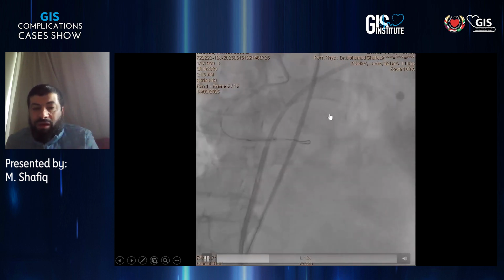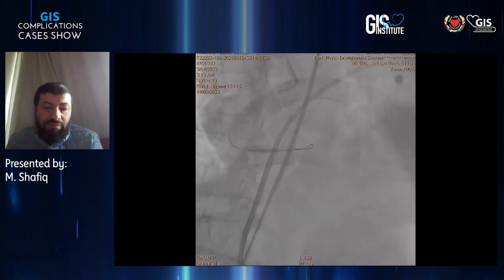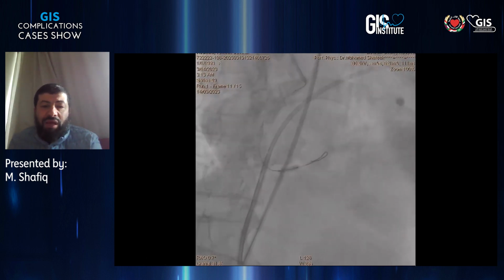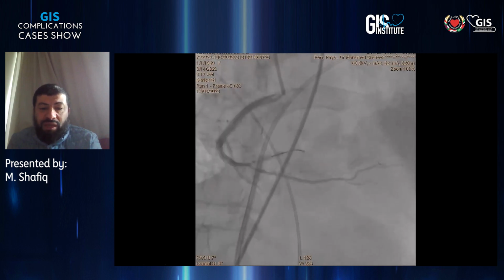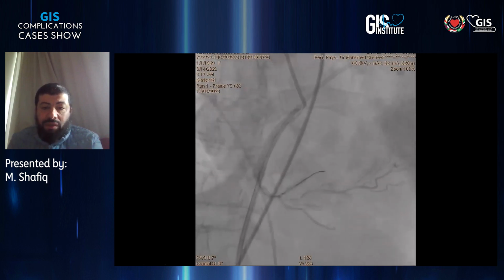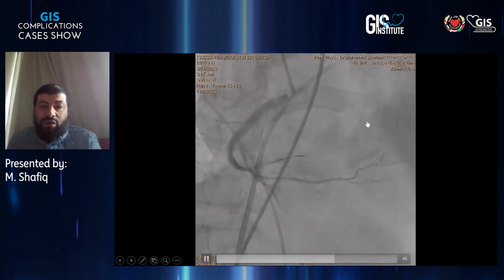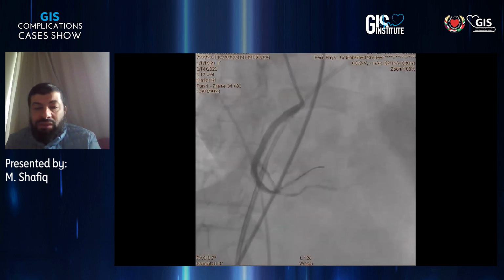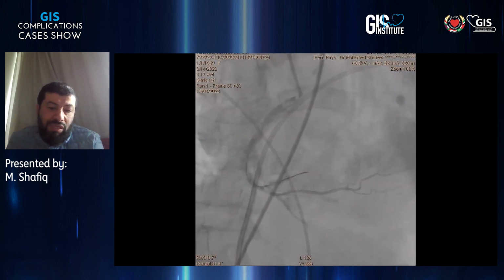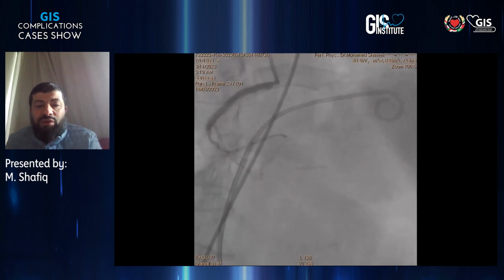So I went for pericardiocentesis and autotransfusion in the jugular vein and inflated my balloon again in the same PL and ensured again there is no flow in the PL. You can notice the syringe of the pericardiocentesis going in front of us, a 20 cc syringe with continuous aspiration and auto-injection in the jugular vein.